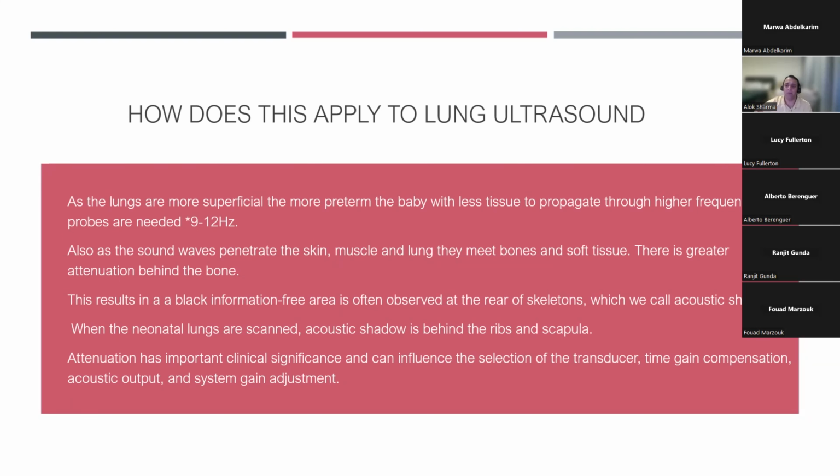Now, where does that become a problem? So if I'm in the axilla and I'm trying to do a probe in a baby that's moving with his arm down, I'm not going to get good alignment and my image quality will suffer. But if I get the nurse to contain, and we're going to go through this, and abduct the arm, actually this allows me to align the probe better in a direction that I want to do without the baby being upset, angry, and really that'll give me better image quality because of the nature of how I'm using the probe with good alignment, good apposition, and keeping that apposition at a level where the sound waves will be incident at 90 degrees and give me the best characteristics.